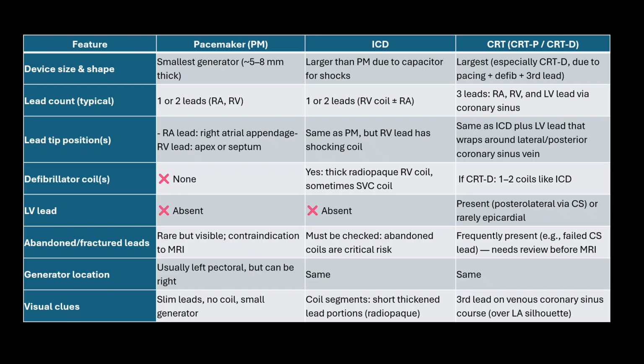In this table, I will summarize the whole lecture and repeat some important information. Sometimes, as intensivists, we face a very important issue: we have a patient in the ER with a device on X-ray, and we don't know what this device is. Sometimes the device is affected or malfunctioning, so we need to know what it is.